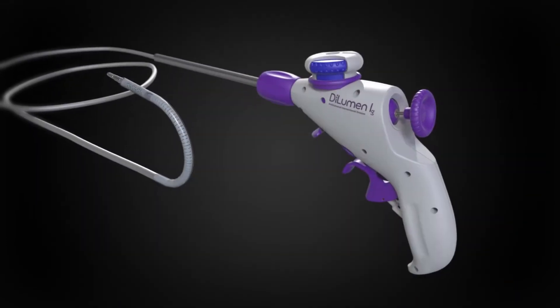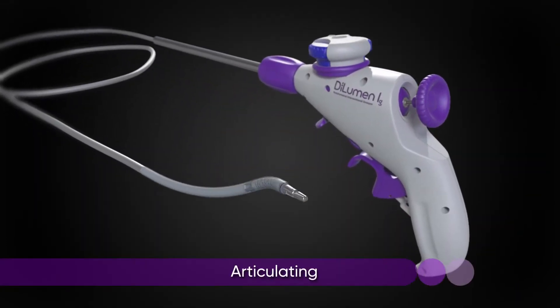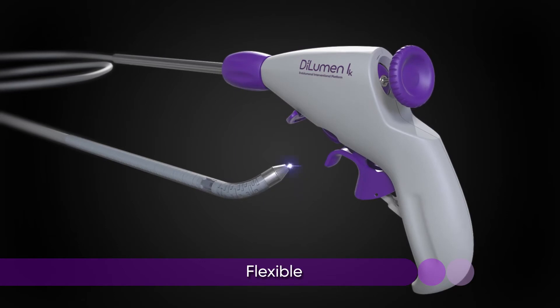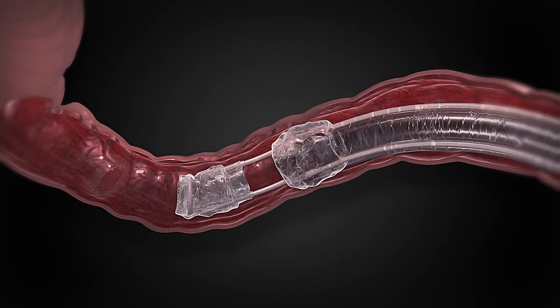These revolutionary articulating instruments are similar in design to laparoscopic hand instruments, but are flexible enough to navigate through the many curves and flexures of the colon.